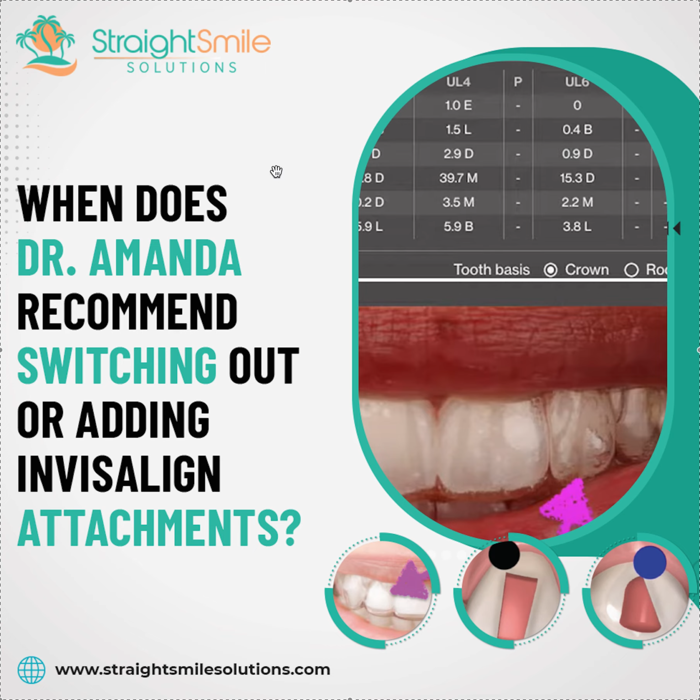All right. Anyways, let's get to the nitty gritty of it. So, like I said, I actually fully believe in their AI. Now, the more difficult the case, if you have a crazy hard case, when we talk about hard, what's hard? Cases with AP issues, anterior posterior issues, your class 2, class 3. Cases with vertical issues, deep bites, open bites. Cases with transverse issues. Cases with impacted teeth, that's hard. Cases with teeth that need uprighting, that's hard. Cases with massive amounts of crowding or spacing, 12 to 15 millimeters, those are all hard. So if you have a case that's kind of unpredictable, their AI might not fully get it.